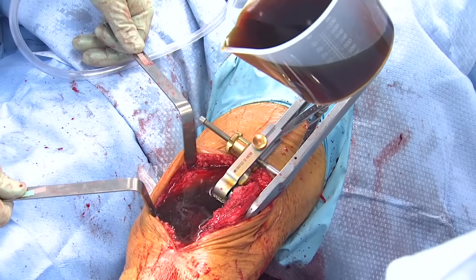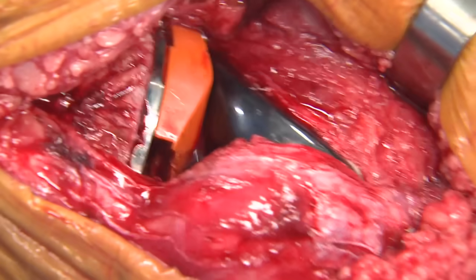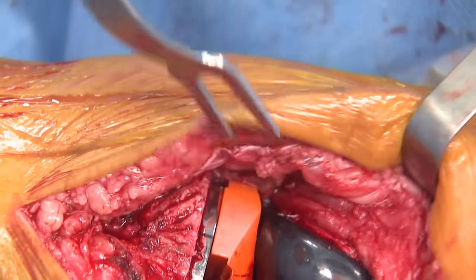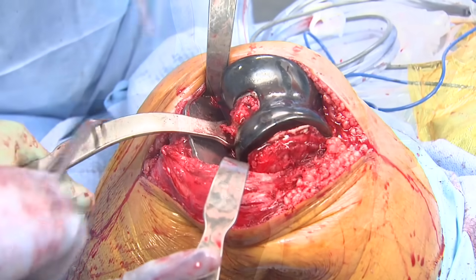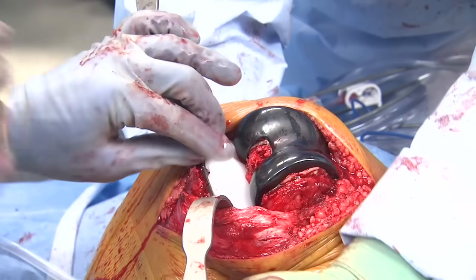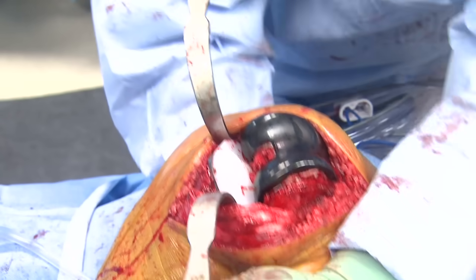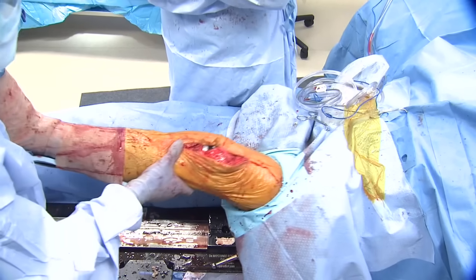The knee is bathed in iodine solution for a period of three minutes and then copiously irrigated. Medial and lateral collateral ligament structures are evaluated for integrity, and any excess or residual osteophytes or loose debris are addressed. The final polyethylene liner is then placed in its final position. As a check, the knee is taken through a full range of motion again and evaluated.